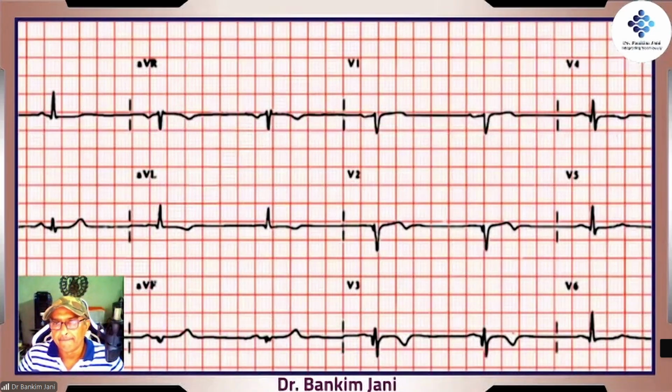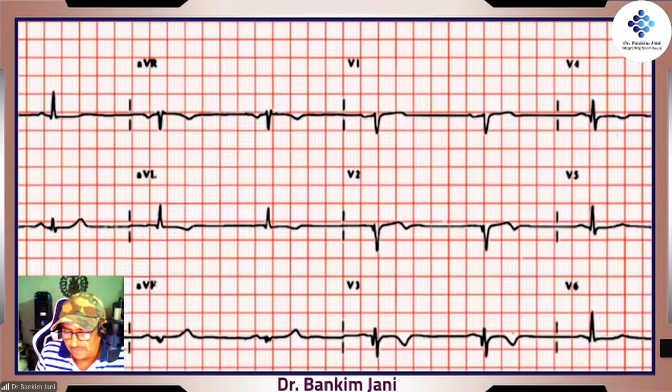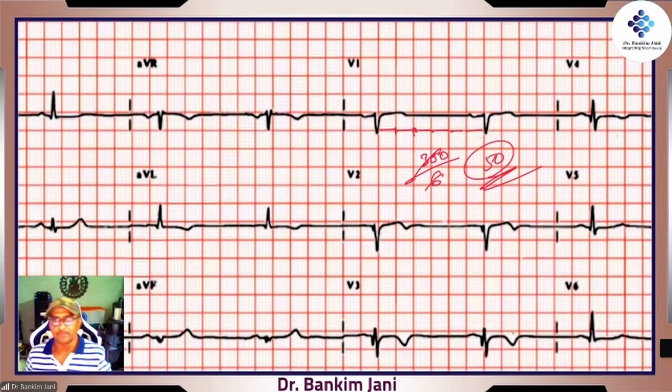Yes. Everyone right? So there it is, 1 box, 2 box, 3, 4, 5, 6. That's right. So here 300 divided by 6, that comes to 50. Right? That's right. This is typical. And if you calculate one more, if your answer is coming to 48, then also it is perfectly fine. 48, 46. Absolutely.